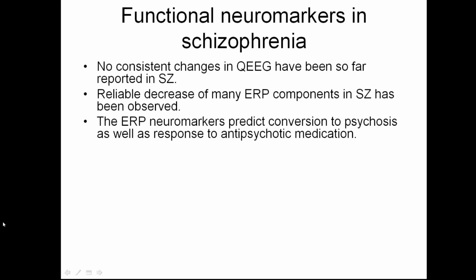We have hundreds of healthy controls. And the first thing we did, we compared EEG spectra of these two groups. So we did not differentiate schizophrenia into different groups. We did not differentiate healthy controls into subgroups. We just wanted to see if there is any overall difference between the EEG spectra in these two groups.